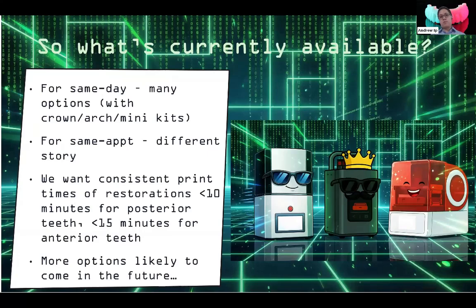So, specific printers available for same appointment or same day workflows. And I do have to differentiate the difference between the two. Because same day, there's many options out there. There's heaps. Pretty much nowadays, any dental 3D printer can do same day. But same appointment is a different story.